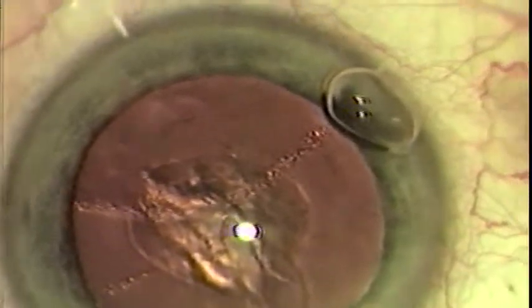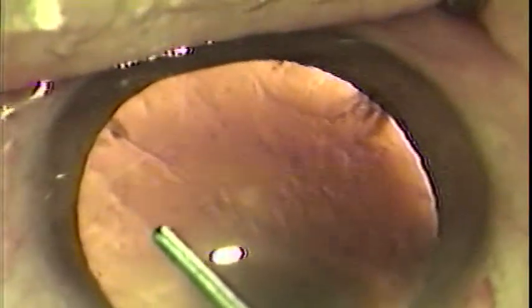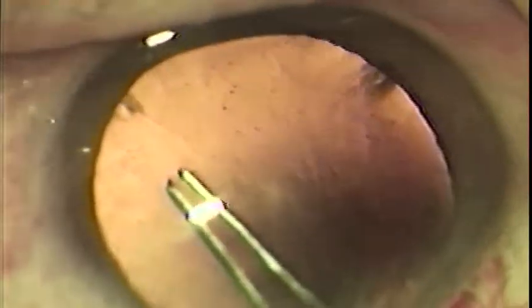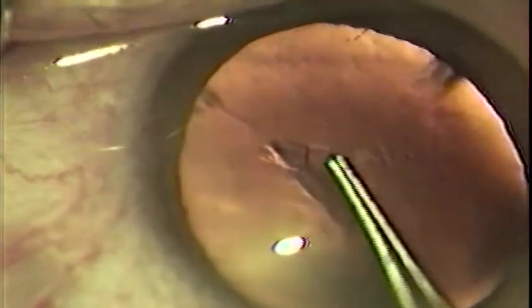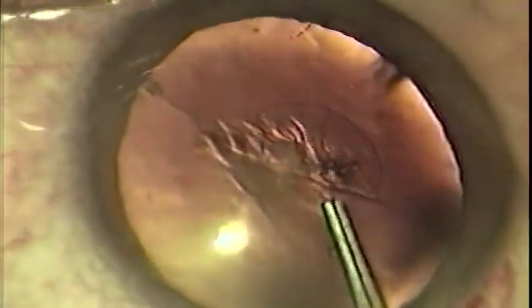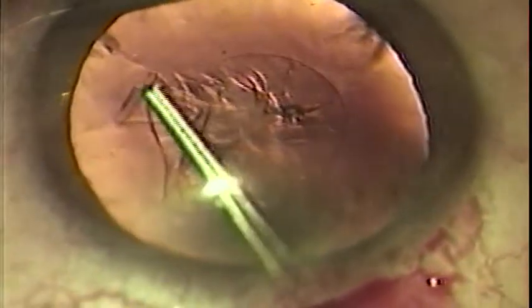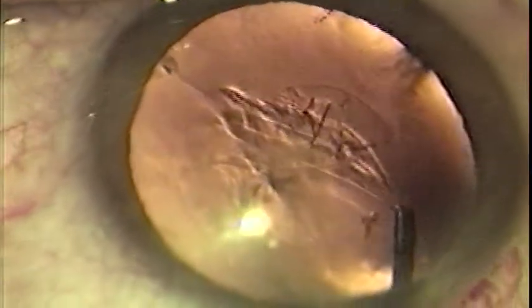Here I will demonstrate several cases showing the maneuvers for opening the anterior lens capsule. The instrument is inserted with the blades closed and slightly rotated counterclockwise. As the blades are opened, the capsule can be grasped. If the capsule is quite elastic, as in this case, it can be difficult to pinch the capsule and start the tear. This maneuver may need to be repeated more than once until an edge of capsular flap is created. Once the edge is created, it can be grasped with the forceps tips and directed in a circular fashion. The key is to grab the leading edge of the capsular tear to enable better control of the direction of that tear.